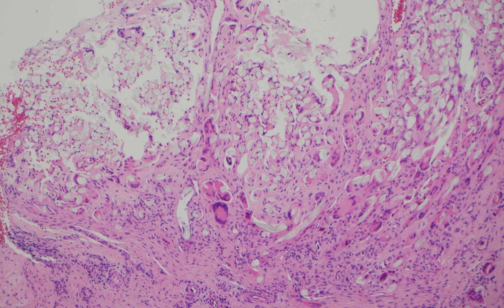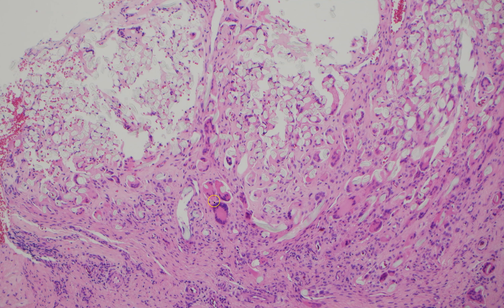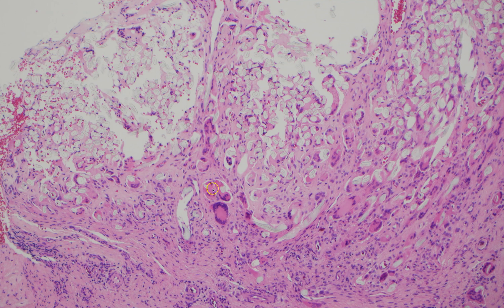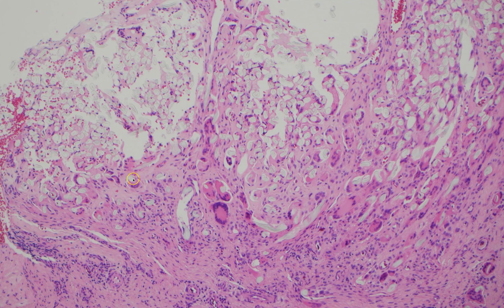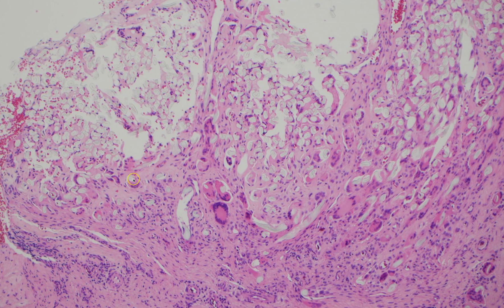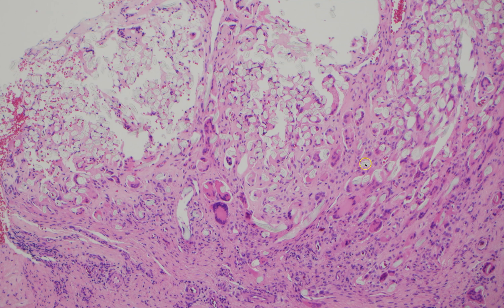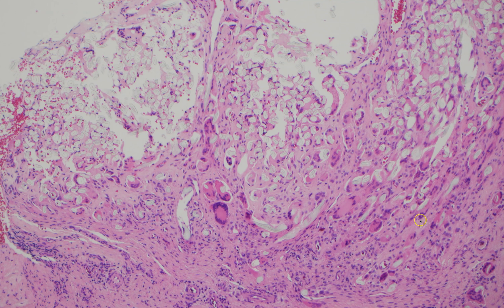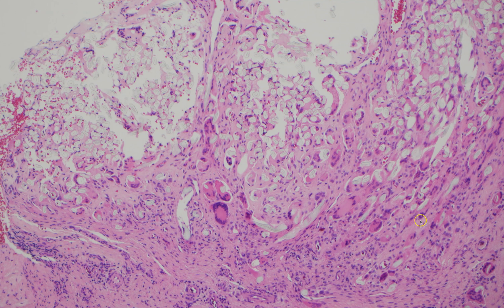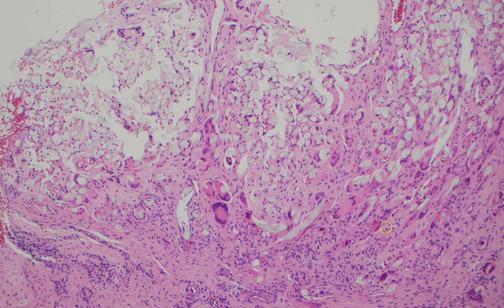But in the background soft tissue in the amputation specimen, I found this. You can see here there are multiple multinucleated giant cells, and they are of the foreign body type — foreign body giant cells — aggregated around little fragments of pale, almost clear material. This is foreign material. I wanted to show this so that you can recognize what a foreign body giant cell reaction or foreign body granulomas look like.